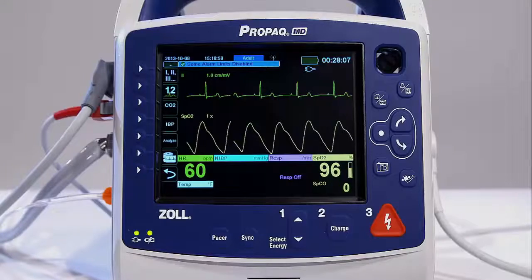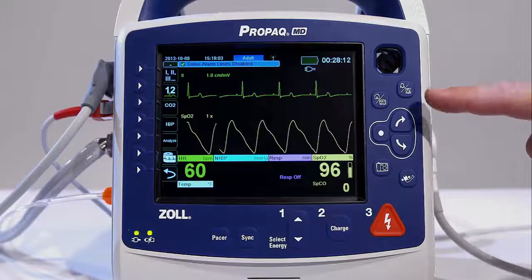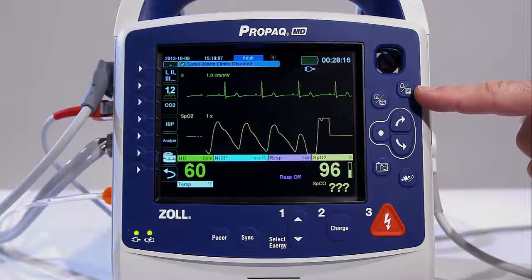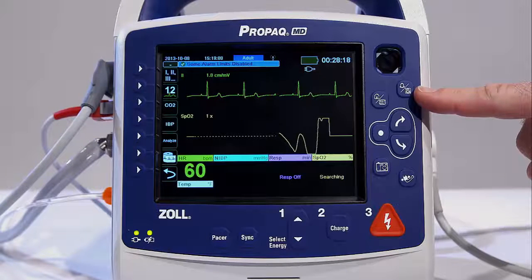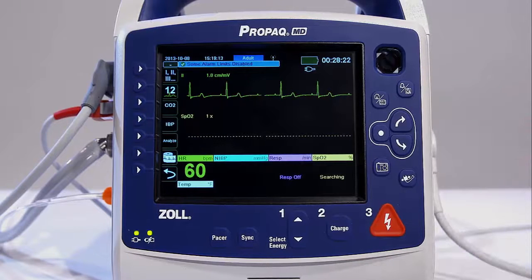The Alarm Reset Suspend key both temporarily silences vital parameter alarms and acknowledges or resets functional alarms, such as leads off, cable off, etc. When caring for a patient, you may want to suspend potential or current patient alarms and equipment alerts for a period of time. For more information on how to set alarms, please review the Quick Access Key module.